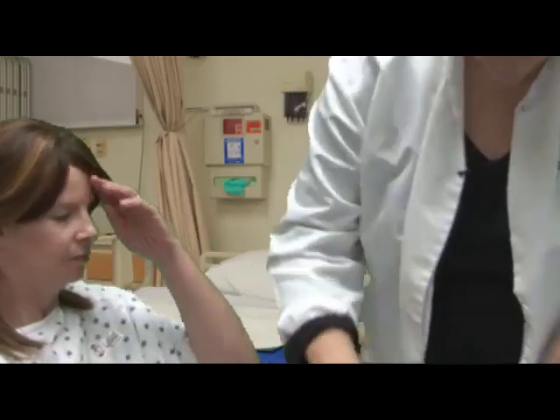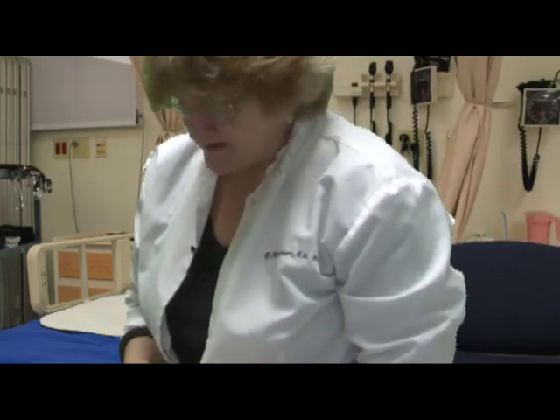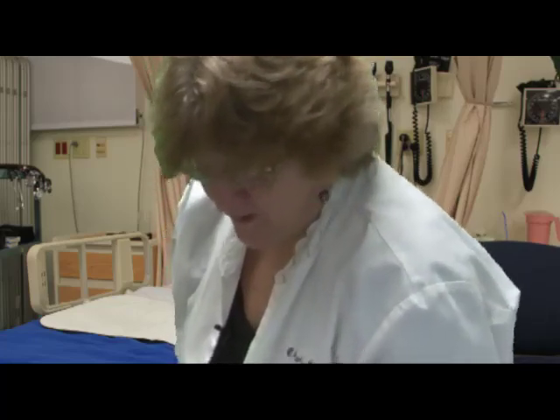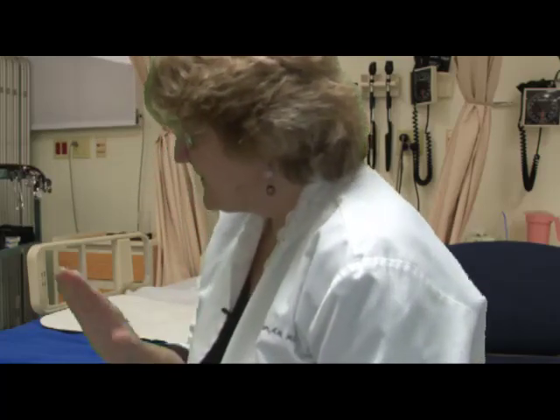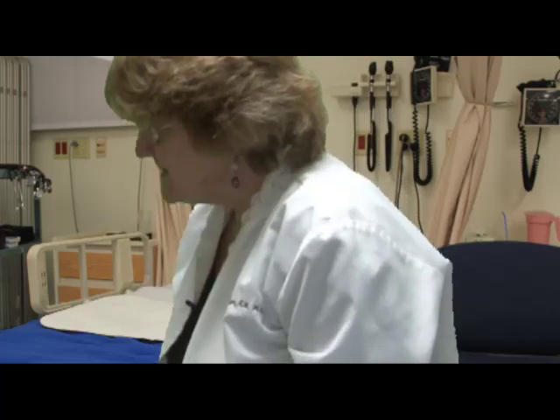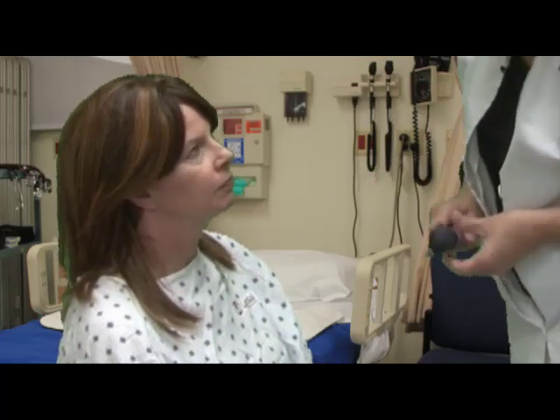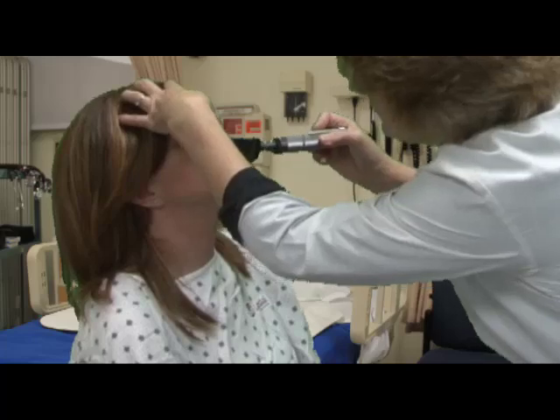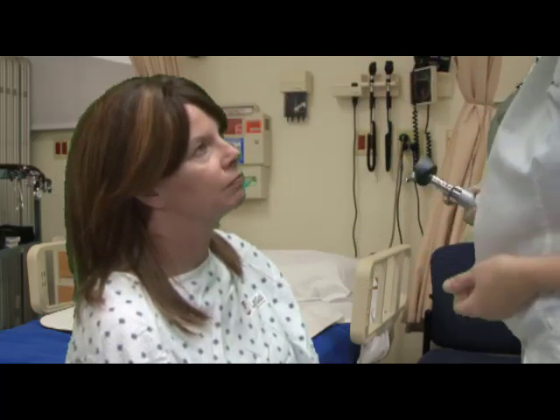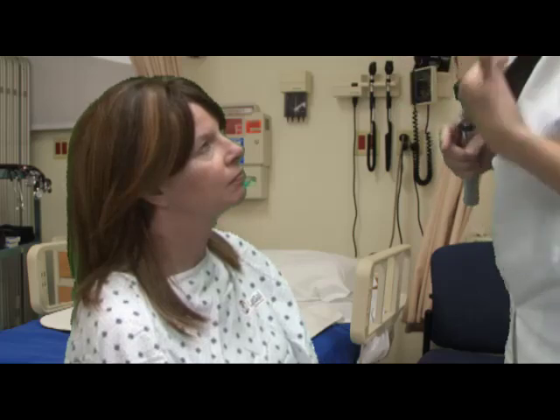Now I'll check the nose. We don't put a speculum inside the nose. First I inspect externally — the nose looks straight on the face with no deformities. I ask her to occlude one side and sniff, then the other side; that's a patency test. Looking in with my light, her nose is a little red — possibly allergies. The mucous membrane is slightly red but I don't see any deviated septum. I'll wash my hands again since I touched her nose.